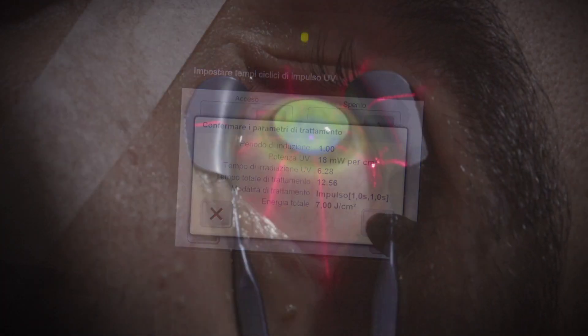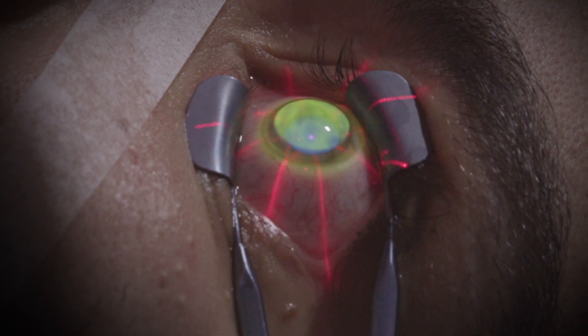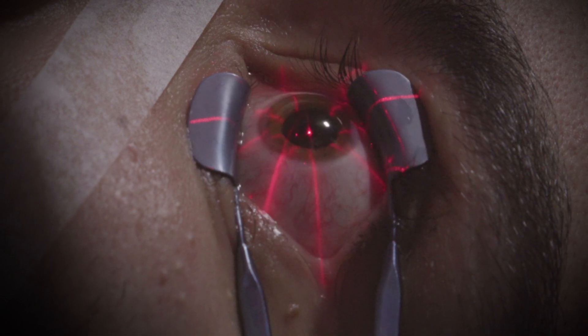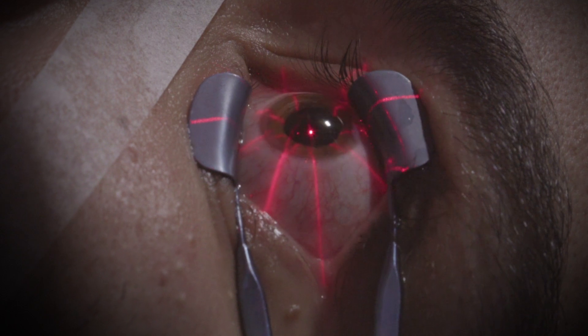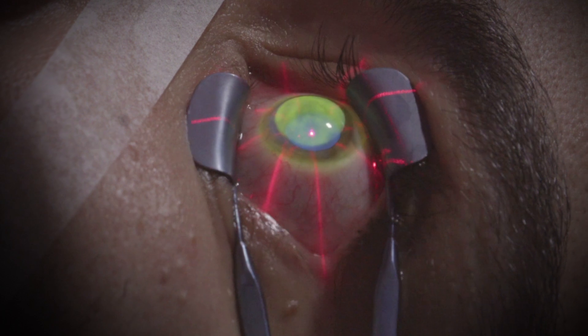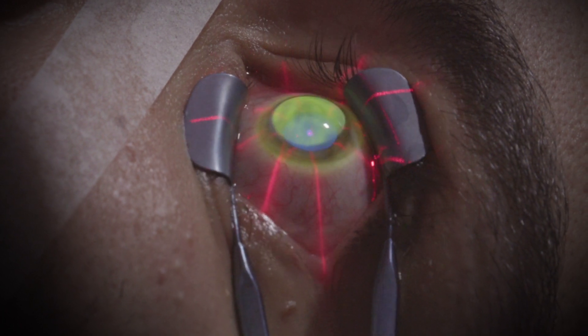We start the pulsed light treatment. The power of UV is 18 milliwatts per centimeter squared. The pulsed light is one second on, one second off, to increase oxygenation of the corneal surface and partially compensate for oxygen consumption from the corneal epithelium.